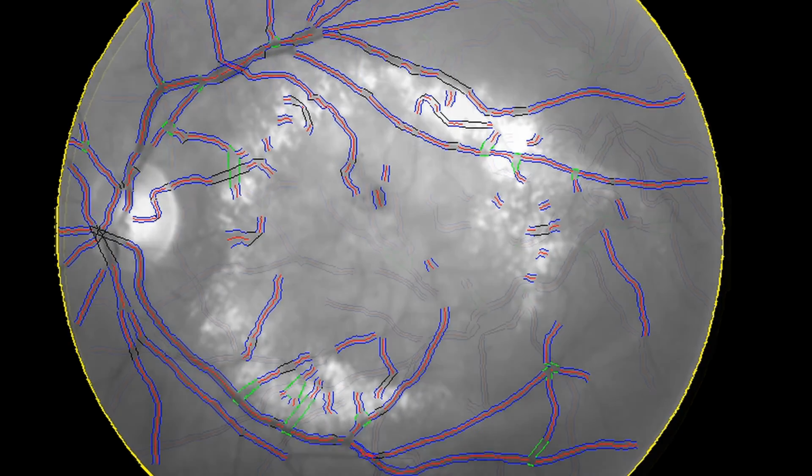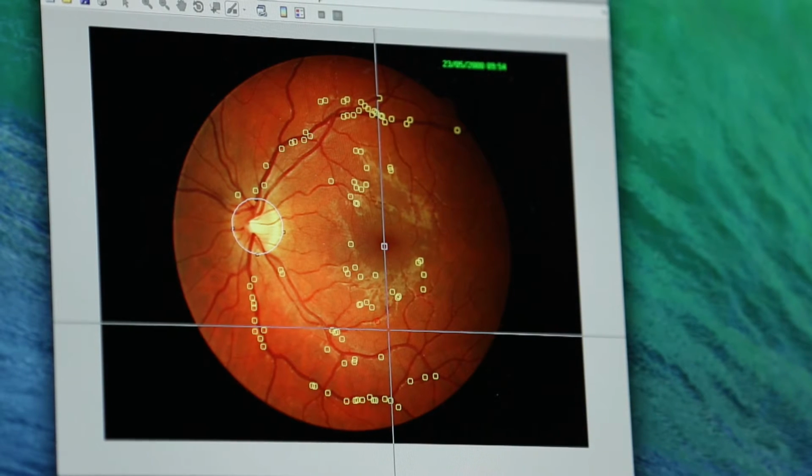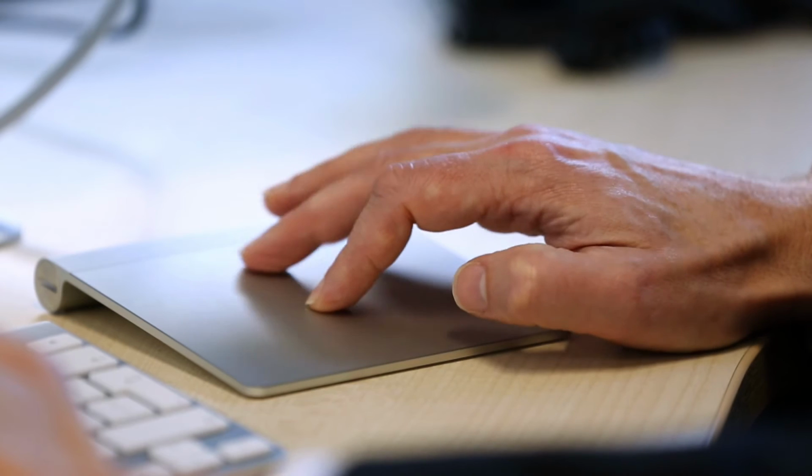We started by looking at a very specific condition, diabetic retinopathy, very important medical condition, and looking for lesions in the eye. Over time, we've realized we need to understand how the whole structure of the vessels is changing. And so we're now moving towards modeling the entire structure of the blood vessels, any modifications that may happen, and then looking at the relationship to diabetic retinopathy and many other diseases.